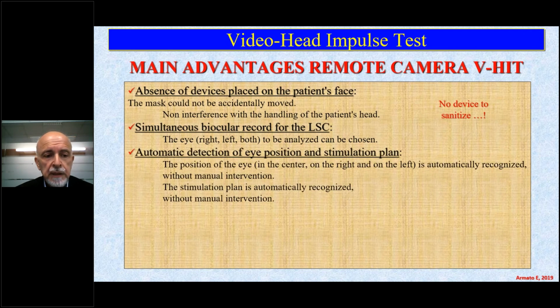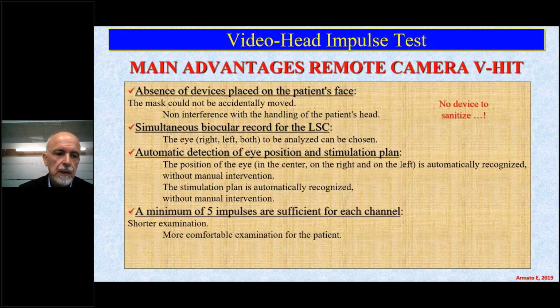There is an automatic detection of eye position and stimulation plan. A minimum of 5 impulses is sufficient for each canal. Shorter and more comfortable examination for the patient.